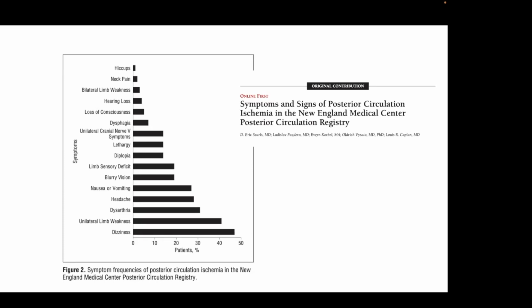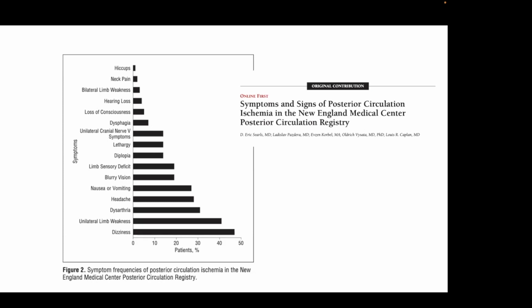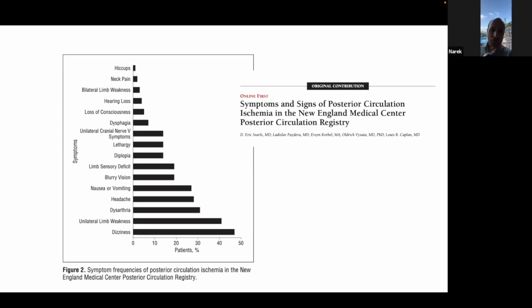I have a question, Alex. Yes. As I work in a hospital which doesn't have a stroke program, we have a couple of cases where a patient just walks into the MRI clinic and we find this kind of stroke in his images.